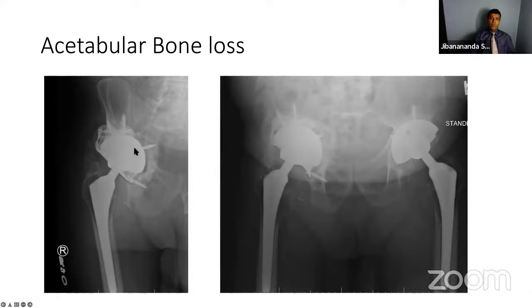But anyway, we put in a big cup, a jumbo cup, though I don't remember the cup size. Then you use a cage to protect the cup, and then we cemented a liner. I do use a tripolar construct for stability, with a bipolar head ball instead of a regular head ball. And he's still doing well. He's about 3 years out, due for his 2-year follow-up. He was doing really well and had no issues with the cup. It's nice. You can see how the bone has grown in there. Pretty much the cup is grown in and it looks great.